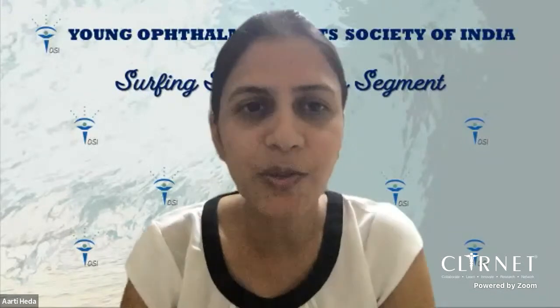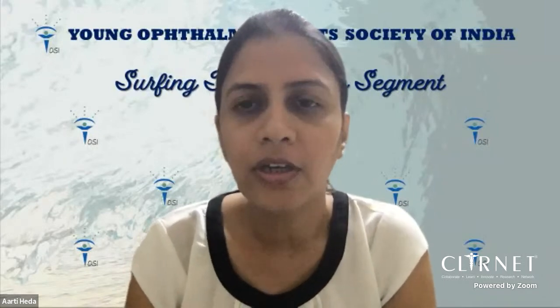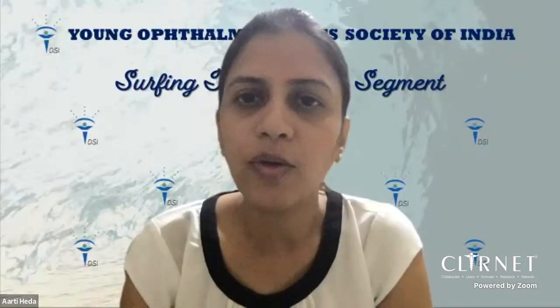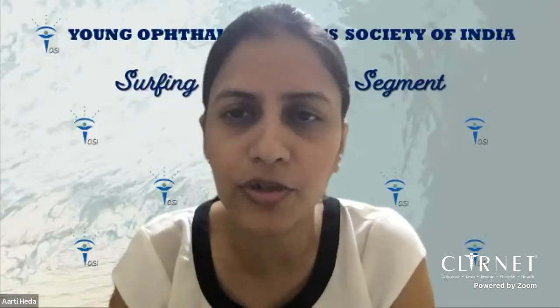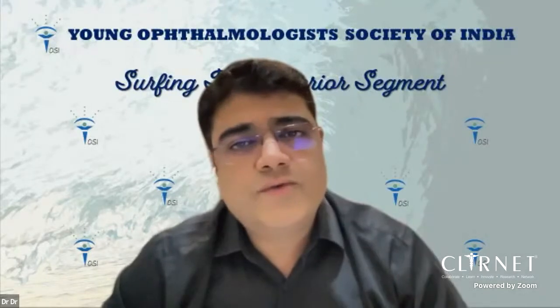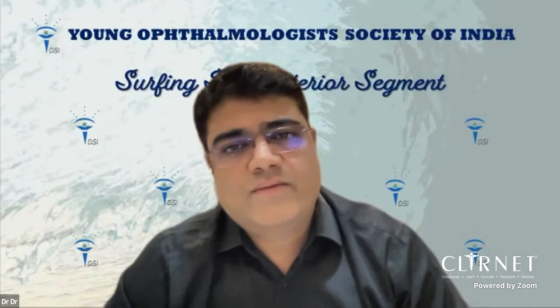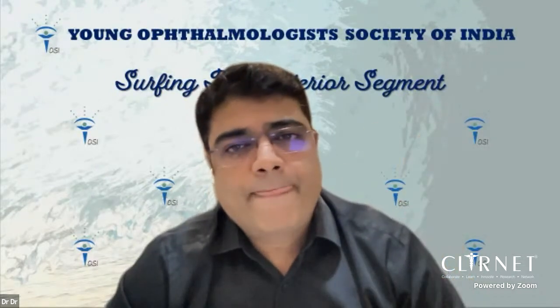Sir, I wanted to ask one question. You showed usage of triamcinolone once you have noticed that there is a vitreous loss. So do you routinely advise using this, or should we selectively go for it? No, you should use it. You should always try to stain and visualize, because we may miss small strands which are there.